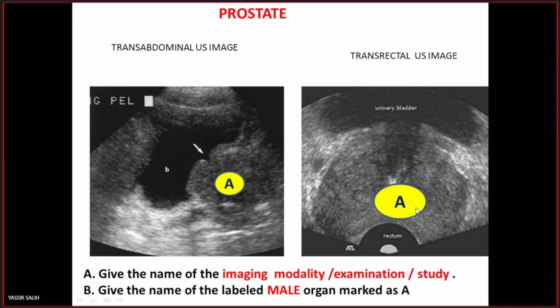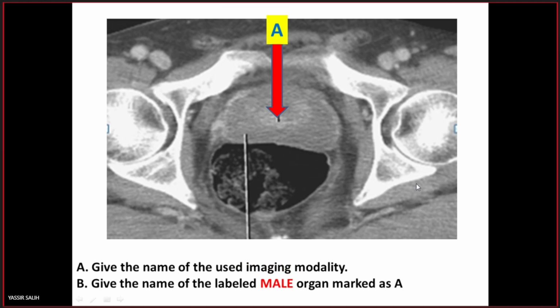And what is this? A. Also, this is a prostate. Give the name of the used imaging modality. CT. Why CT?